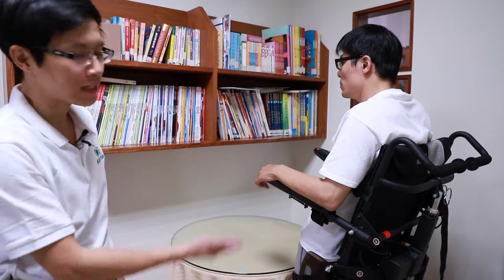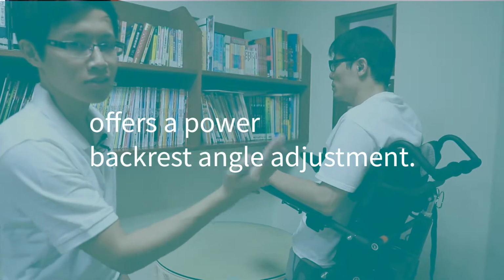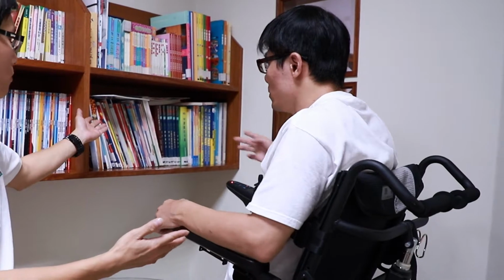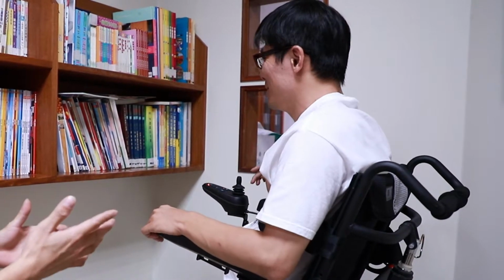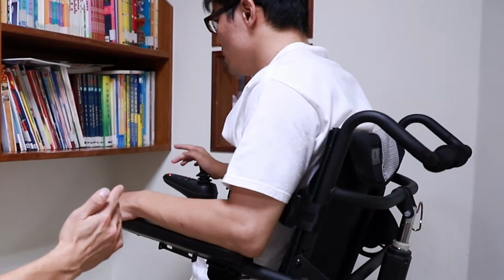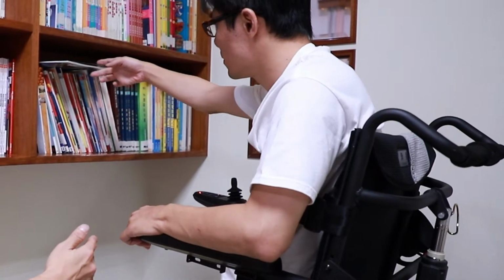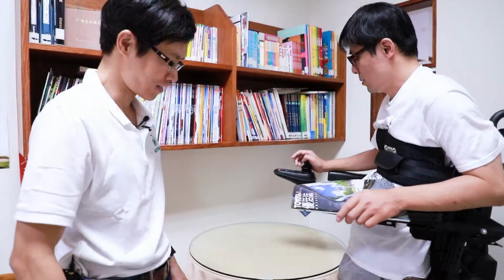Besides the standing up function, Ergo Stand also offers a power backrest angle adjustment. The user can open up the seat to back angle when he needs to rest on the chair. But more importantly, the angle can be adjusted anteriorly. The anterior seat to back angle can give the user extra support when he needs to lean forward and grab something from the shelf.